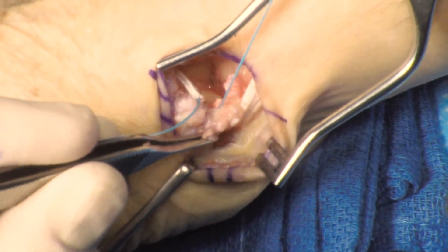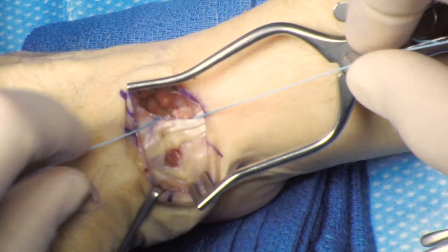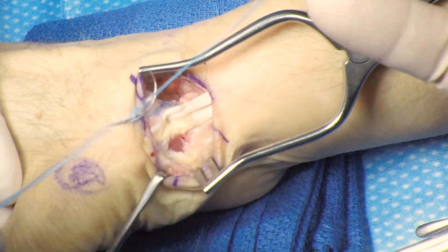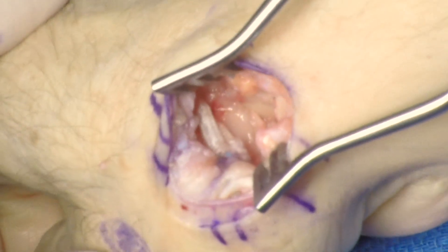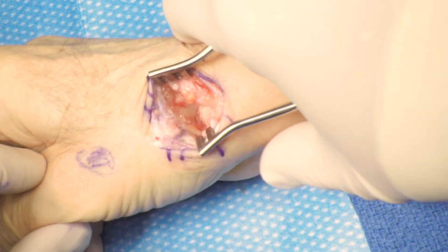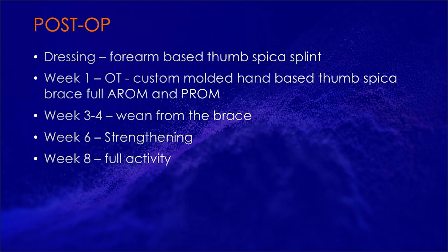I use one suture passed through and back to have the knot on the deep surface of the tendon within the arthroplasty space, so you don't have a large knot stack that is superficial and can be irritating. The thumb is positioned in abduction and the suture is tied. The sling is inspected and appropriate tension is confirmed. The thumb is loaded confirming stability. Final fluoroscopy shots show an acceptable arthroplasty space with no evidence of over-tensioning or under-tensioning. The patient is placed in a forearm-based thumb spica splint. They can begin occupational therapy at one week post-op, have a custom-molded hand-based thumb spica brace made, begin full active and passive range of motion, wean from the brace at weeks three to four, begin strengthening at week six, and typically return to full activity at week eight.